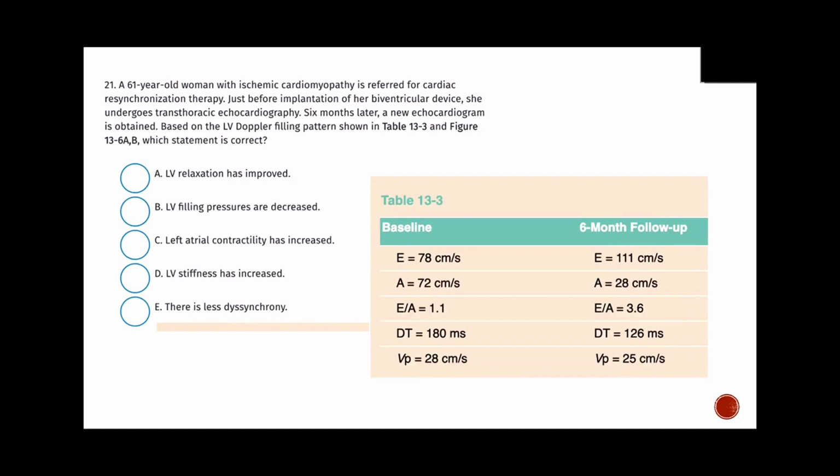So our E to A got worse, right? Anybody else? LV, you think the pressures have decreased? No. No. LV stiffness. Good.